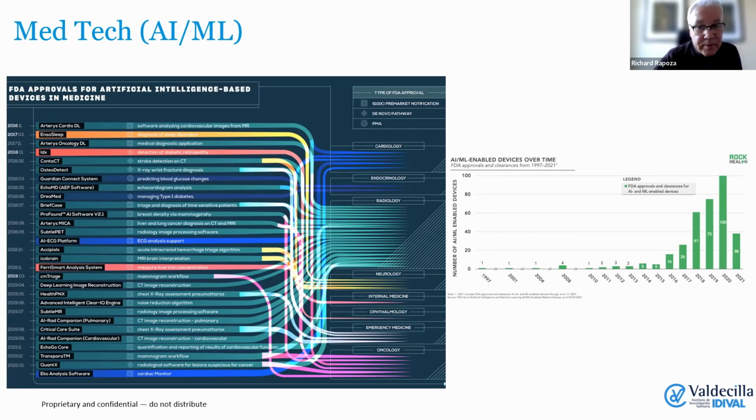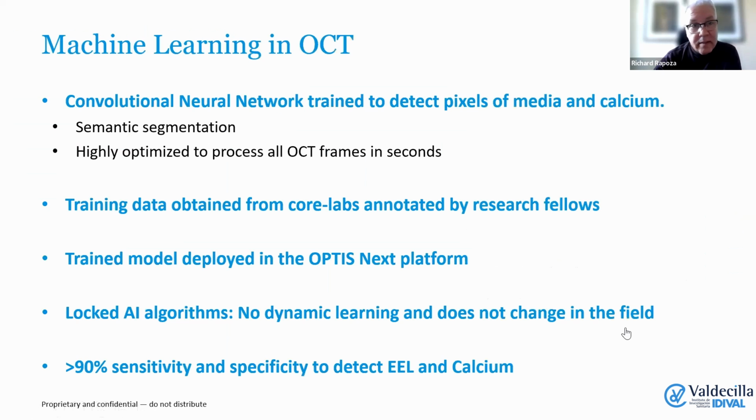You can see here pertaining to cardiology, for example, ECG analysis support, cardiac monitoring, automated interpretation of pacing leads, etc. A substantial amount of them are approved in different areas, specifically a lot of it in neurology. And you can see the number of approvals has really gone up, tamed a little by the pandemic, but then continued as we speak.